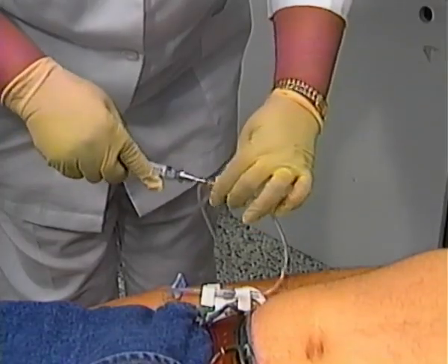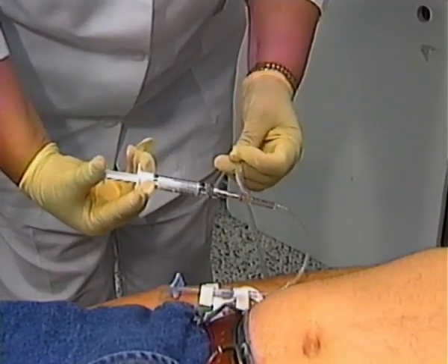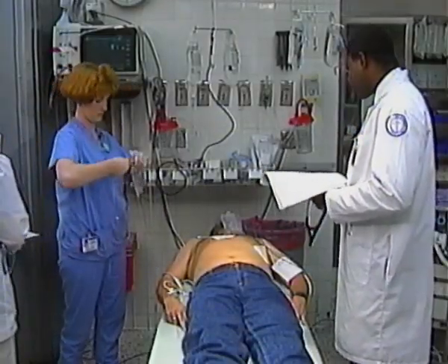His blood pressure is now 122/74. Lidocaine has been administered. Continue monitoring his vital signs until he stabilizes and watch the monitor for any arrhythmias. And in the meantime, we'll get him ready for CCU admission.